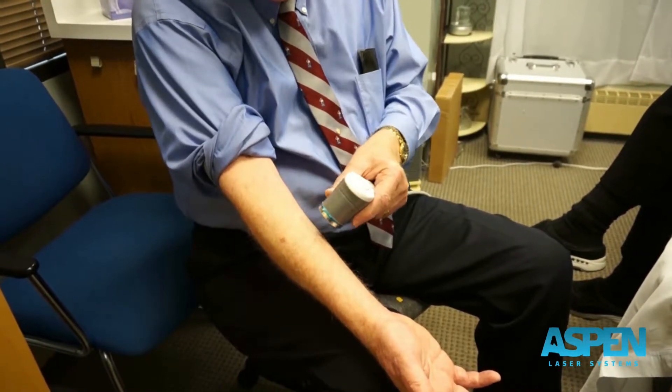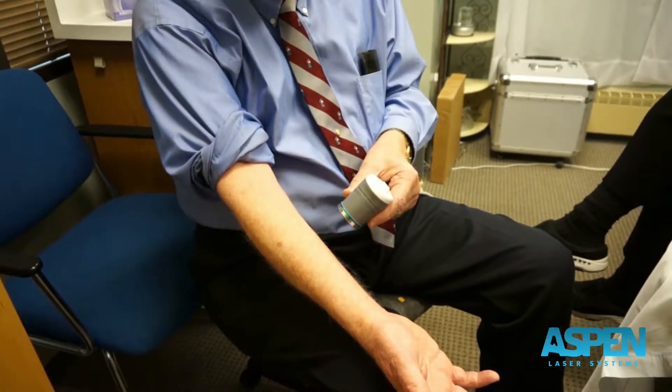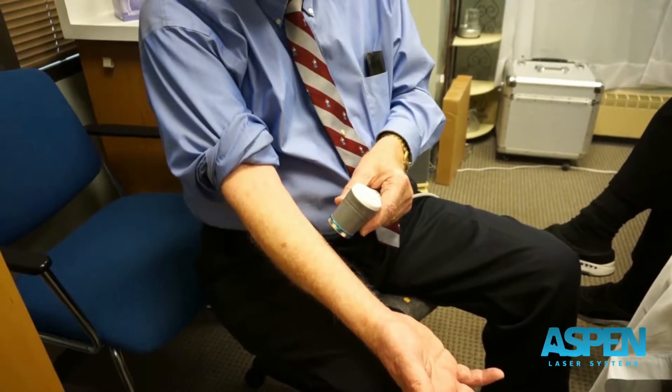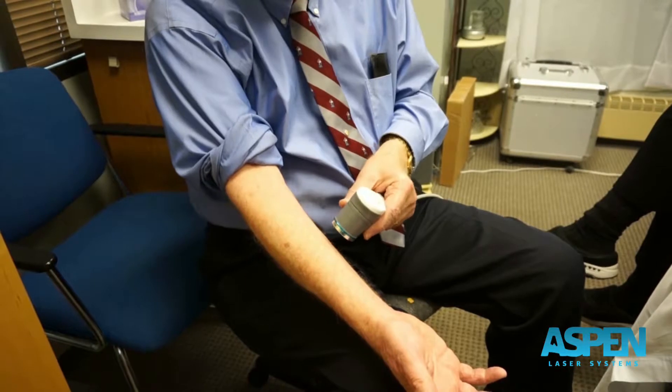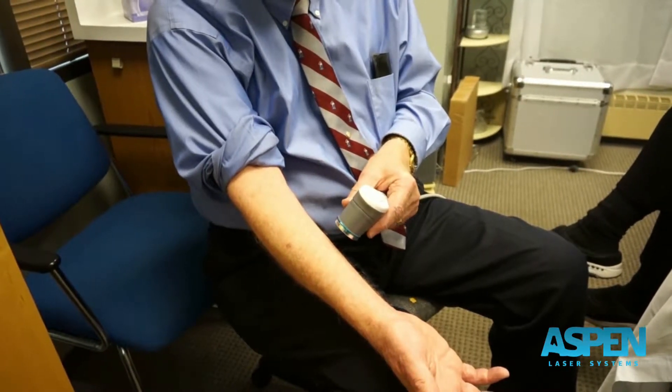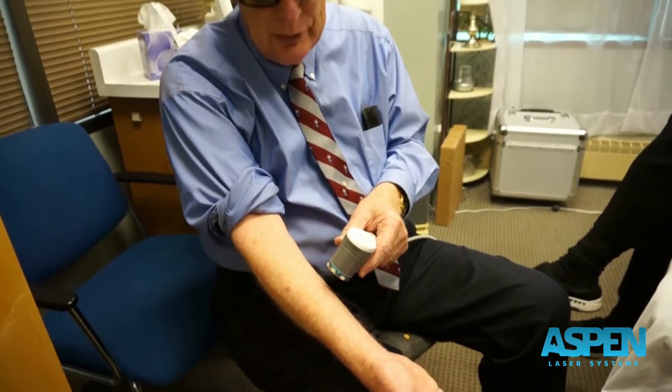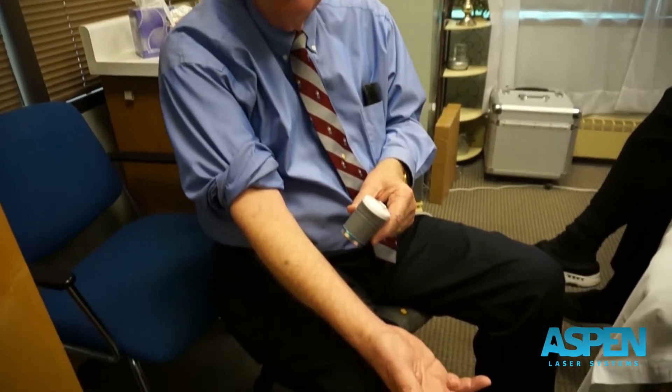The further you move this away from the skin, you delete the amount of near-infrared going into the skin, and it's rather dramatic. Based on our estimates from tissue research, for about every inch you're going to lose between 15 to 20 percent.